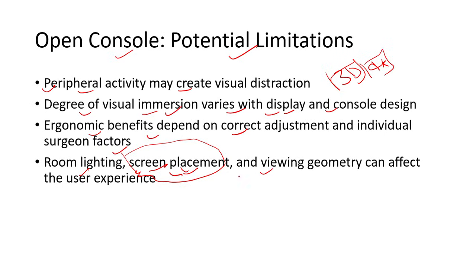The viewing geometry can also affect the user experience. One surgeon is sitting in front, some are sitting beside, and some are sitting higher up, so they cannot see the 3D view properly. It's like going to a 3D movie, where you have to sit at a certain distance. If you are too near, the visibility is not that clear, and if you are to the side of the monitor, the visibility is also not clear.